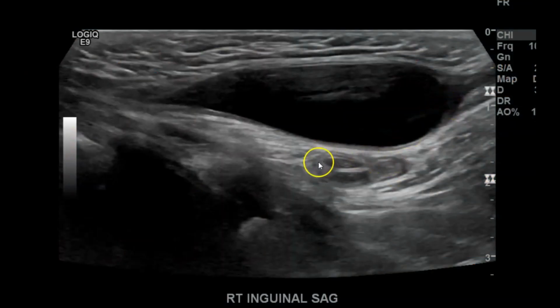And here, since I'm angling from the inguinal canal towards midline, this will be a little piece of the pubic bone. And then this right here is the penis. So you've got the corpus cavernosum, and corpus spongiosum. So yeah, this was a case of encysted hydrocele.